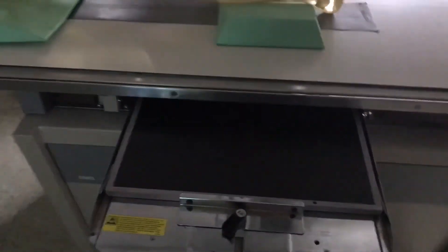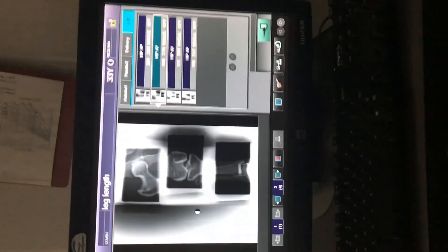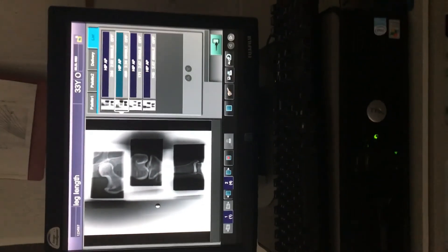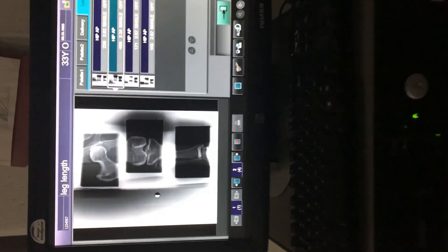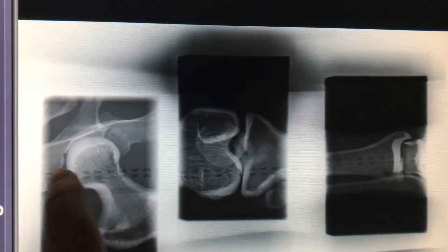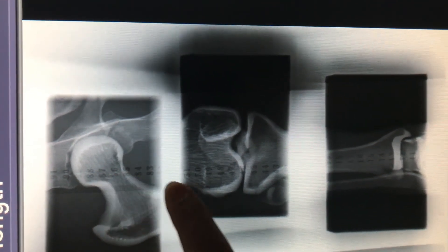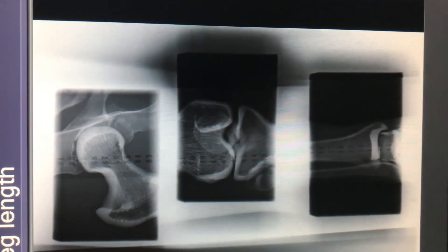Take your cassette out and bring it over to the Fuji processor. I usually choose knee AP, but you could choose hip AP as well, and process the 14x17. This is kind of what it's gonna look like — you should be able to see the numbers underneath your anatomy. The numbers are going through the hip joint, the knee joint, and the ankle joint. Your radiologist is going to make their measurements from there.